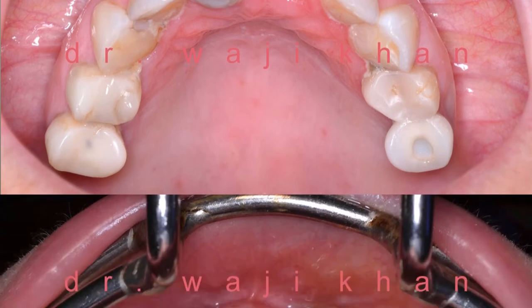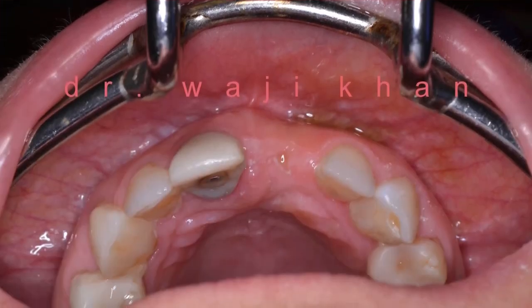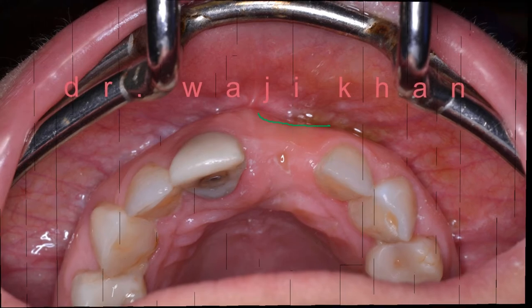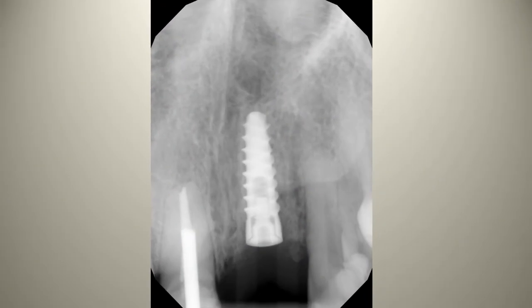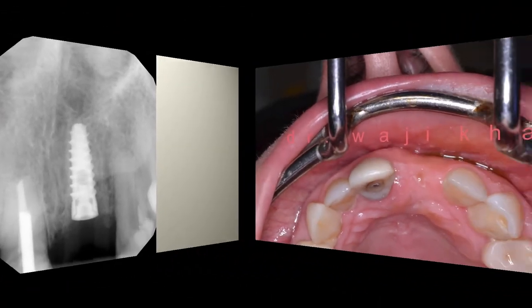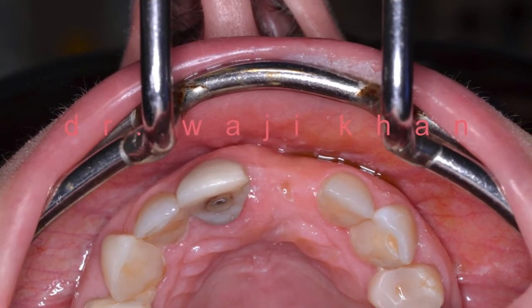At four months there has been a bit of a dip in the soft tissue from the buccal-lingual perspective. Here is the radiograph showing what things look like at the four-month mark, and here is another shot of the same.